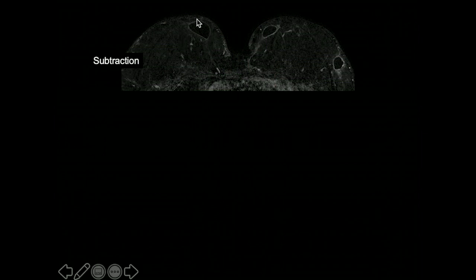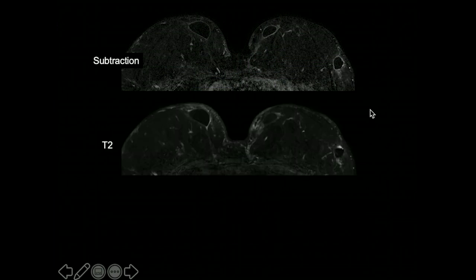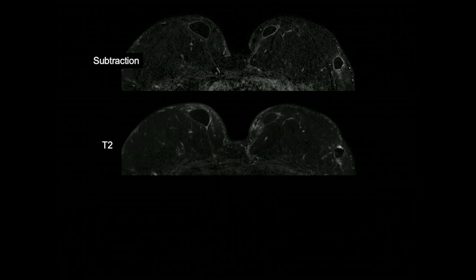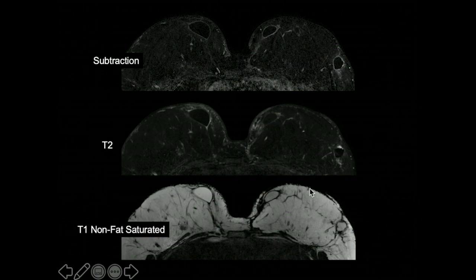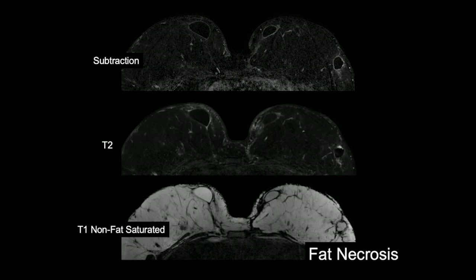In the final case, a subtraction image from a bilateral breast MRI shows rim-enhancing masses bilaterally with thin rim enhancement. On T2-weighted images, these masses are not T2 bright internally, so they are not cysts. The thin, uniform peripheral rim enhancement suggests benign characteristics. On the T1 non-fat saturated images, the internal characteristics follow fat signal, and the patient appears to have had prior bilateral mastectomies with deep flap reconstructions. This is consistent with fat necrosis.